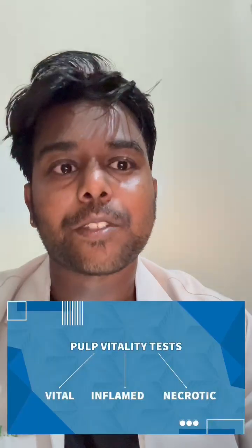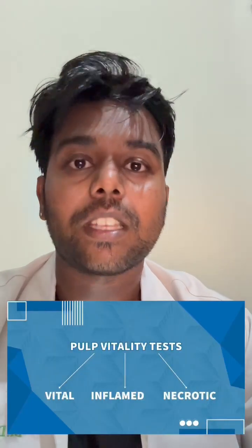Pulp vitality tests are diagnostic procedures used in dentistry to assess the health and functional status of the dental pulp. They help to determine whether the pulp is vital, inflamed, or necrotic. It helps us to arrive at a diagnosis such as reversible pulpitis, irreversible pulpitis, or pulpal necrosis.